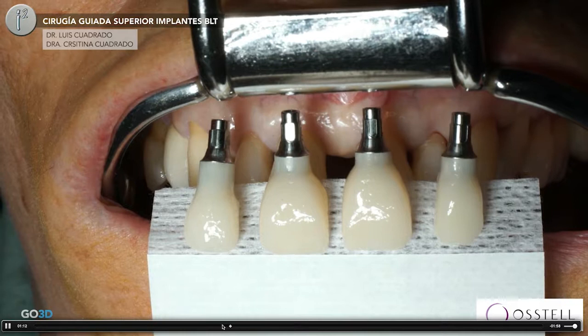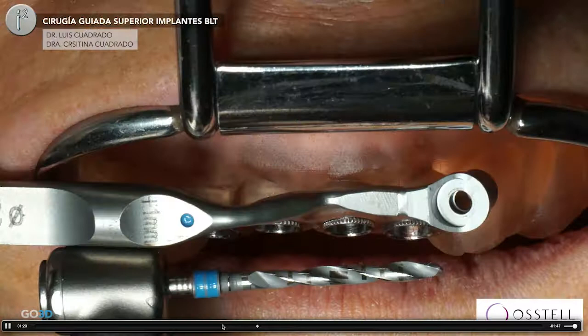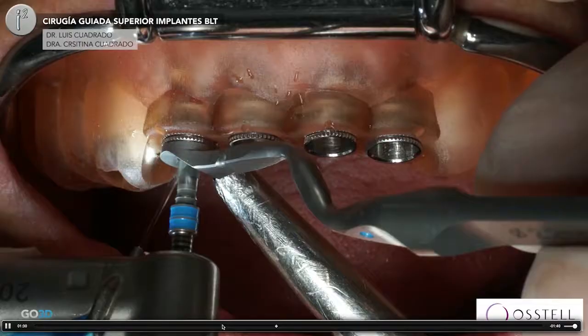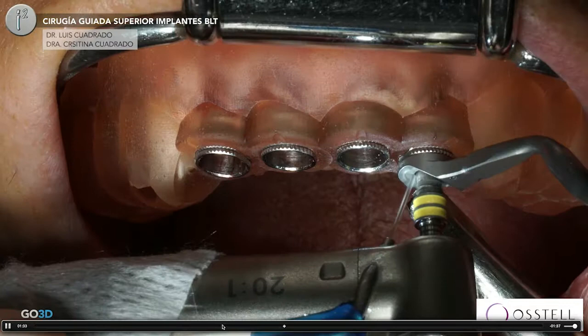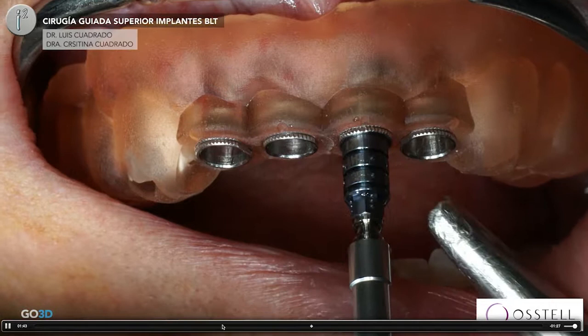Those are the guided crowns prepared, the guide with the slots where I have to stop when I'm screwing my implant. Now, we are going to use again the bone level taper protocol from Straumann. Different combinations, trying to avoid complex cases, trying to maintain all the cylinders at the same height and then with 12mm implants, we are going to place it in our patient.